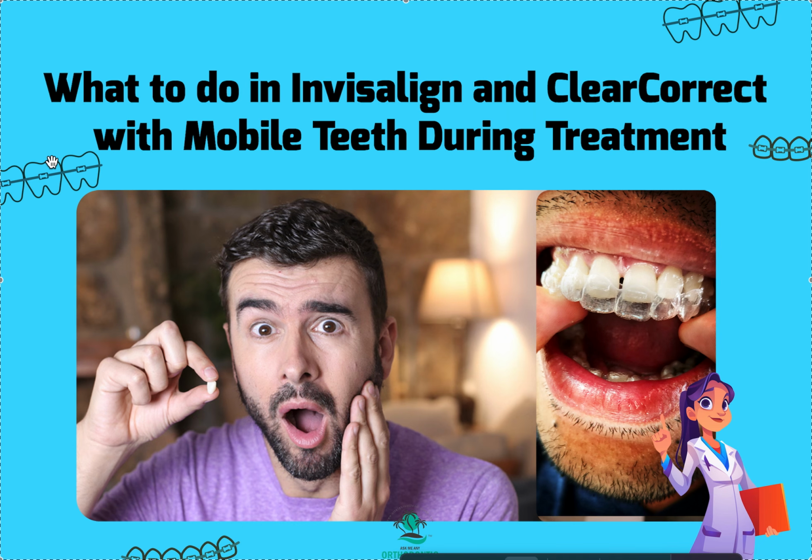And most likely, if this is happening as a refinement, I'm going to go ahead and put the patient in a temporary retainer. And you could order Invisalign retainers right off their website, or you can scan and make an in-house retainer or order it from your local OrthoLab if you'd prefer. And I'm just going to hold the patient in a retainer, which is thicker than a liner and more stable, for maybe 4 to 8 weeks with no occlusion on those teeth.